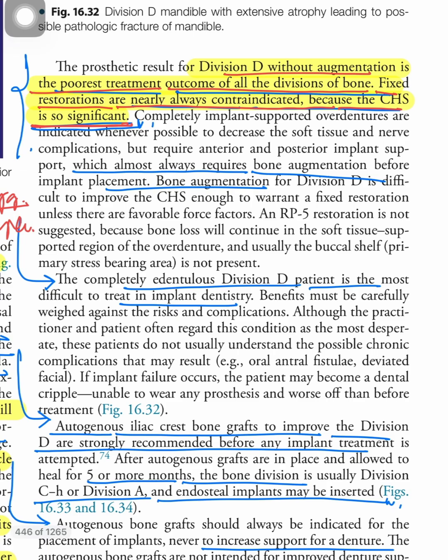See, if you are new to implantology, it is not just about placement of the implant, it is more about the restoration, and how long the restoration would last. Implant failures happen mostly because of mechanical or biological reasons.